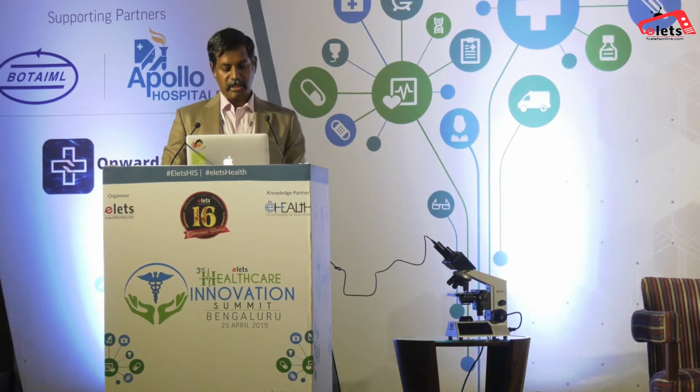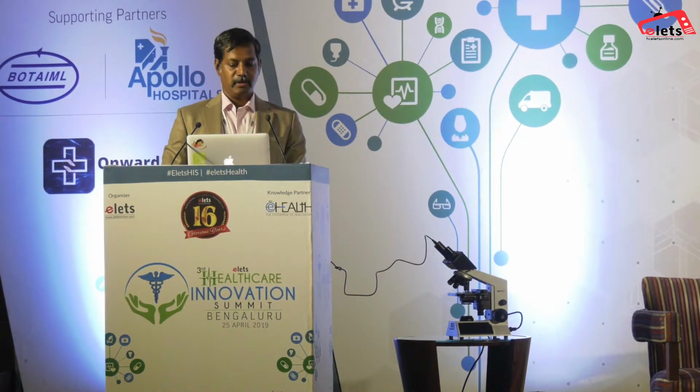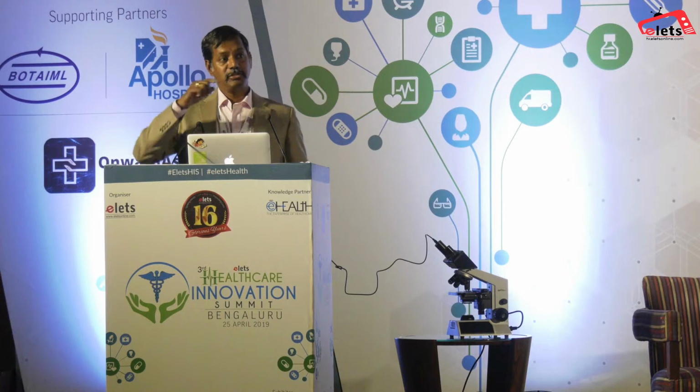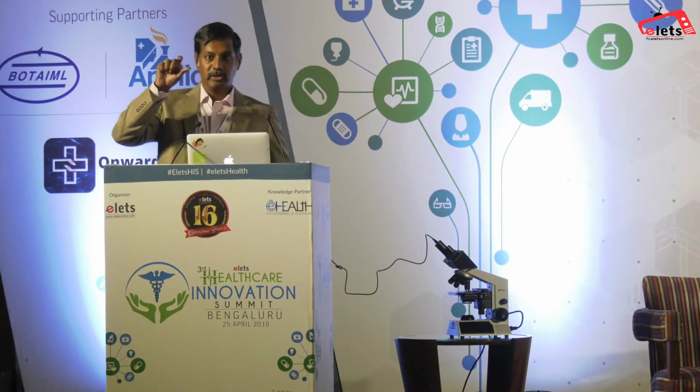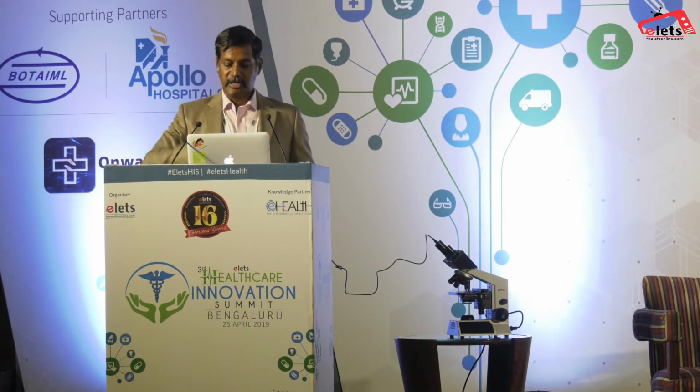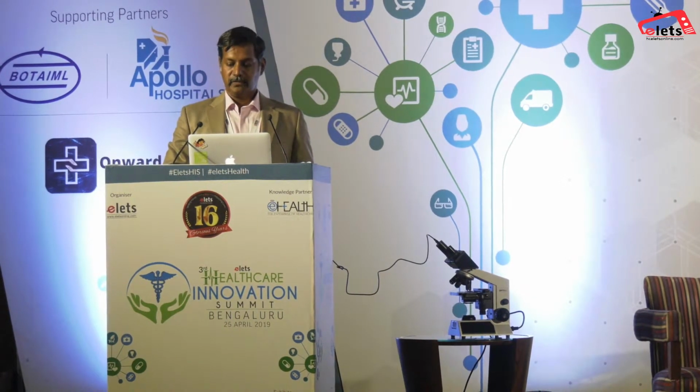I've enabled the live stream, and from the remote, this is actually the pathologist looking at it. Even though the technician was trained to recognize the hot spots and take pictures of multiple areas, the pathologist can still say, I want to see this slide again, and request the slide stream. We have multiple communication tools used here, so that the pathologist can talk to the technician.